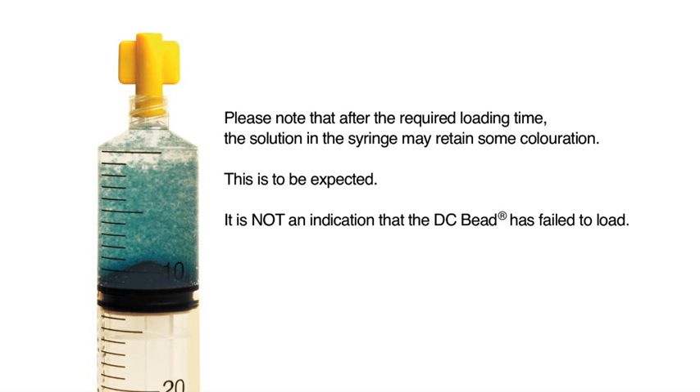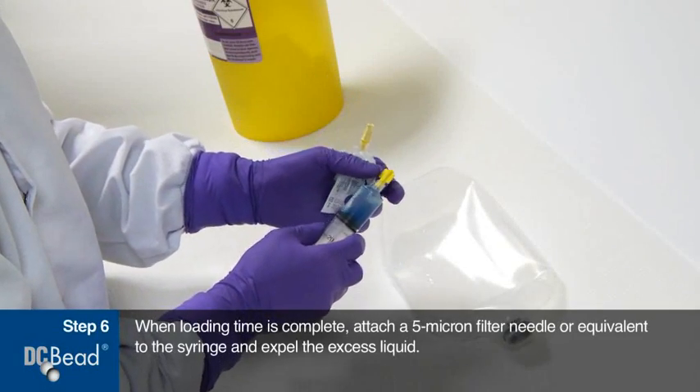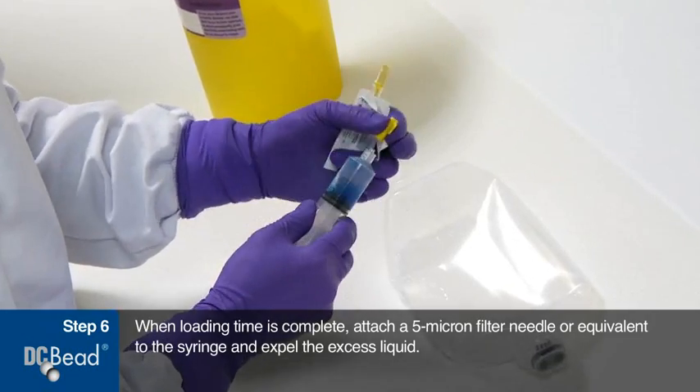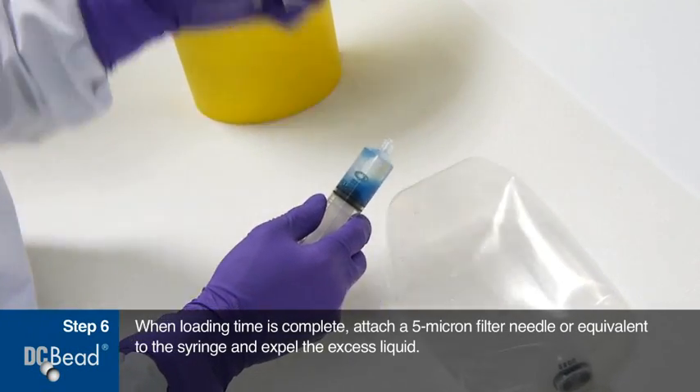Please note that after the required loading time, the solution in the syringe may retain some coloration. This is to be expected — it is not an indication that the DC bead has failed to load. When loading time is complete, attach a 5 micron filter needle or equivalent to the syringe and expel the excess liquid.